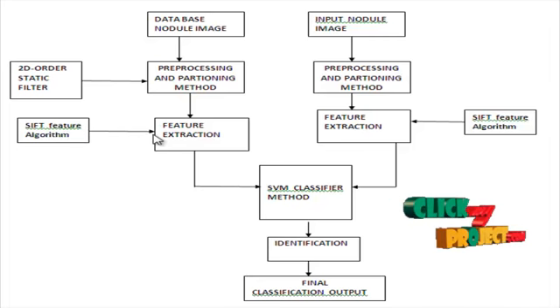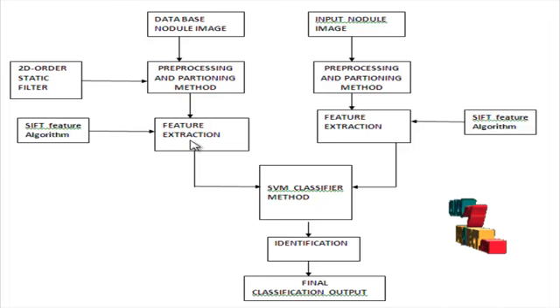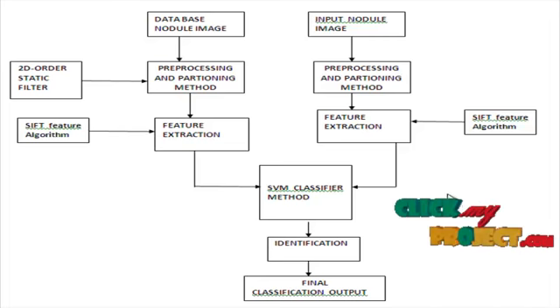In our case, we extract only the 128 length vector near the centroid for each patch, especially since the shapes of the extracted patches are not uniform. We selected the smallest rectangle sub window to cover all pixels for each point, then ran SIFT on this window. Then go to the SVM classifier method.